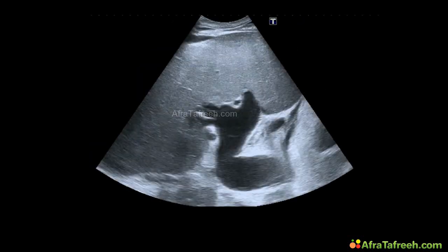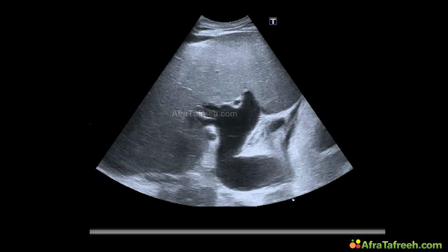And in this video, I show you another organ. This is not the liver, but this is the spleen. Why do I show this to you now? It's because when there's cirrhosis, sometimes there's portal hypertension present. And when there's portal hypertension, there can be splenomegaly. And this dilated vessel over here, beautifully seen, is the splenic vein.